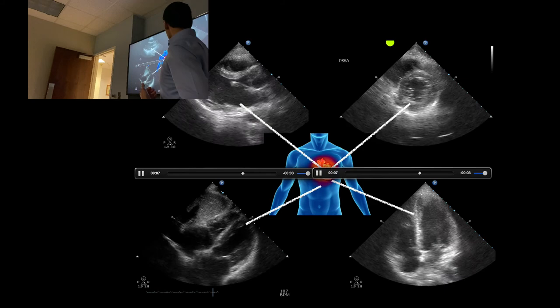If our patient has muffled heart tones and this EKG — this is electrical alternans — what happens is the QRS voltages are changing beat to beat. QRS voltage should be fixed; if it's not, the heart is moving in relation to your EKG leads. Remember just three questions: effusion, function, chamber size. Does this patient have a pericardial effusion? There's black fluid around the heart.